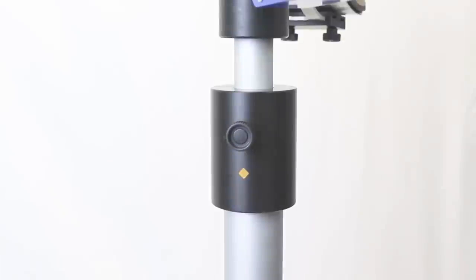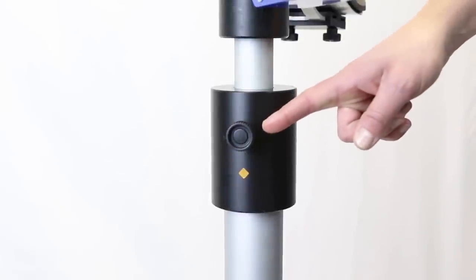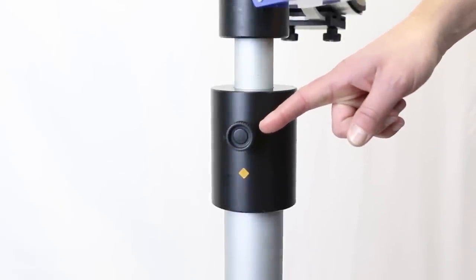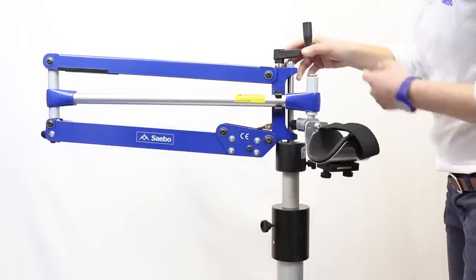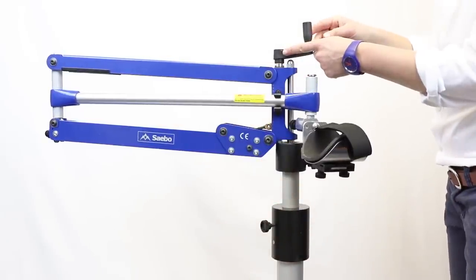I'm going to start by adjusting the height of the device. Using the height adjustable knob to either move the pole up or down. Ideally getting the tension handle in line with your patient's shoulder.